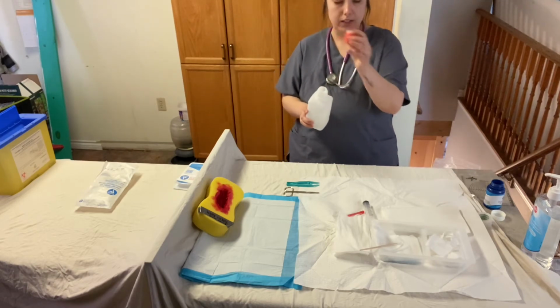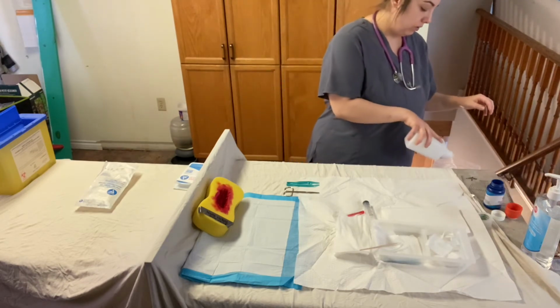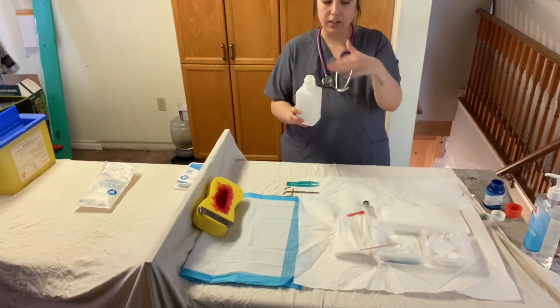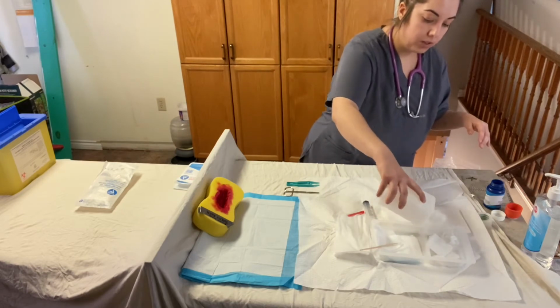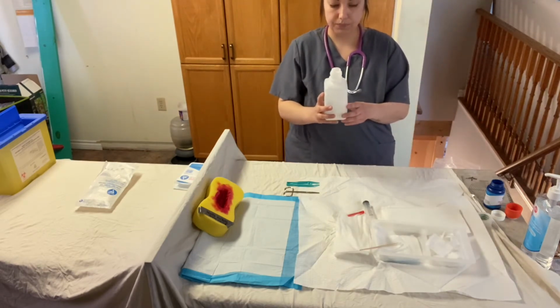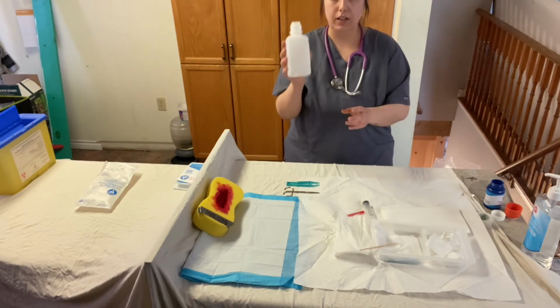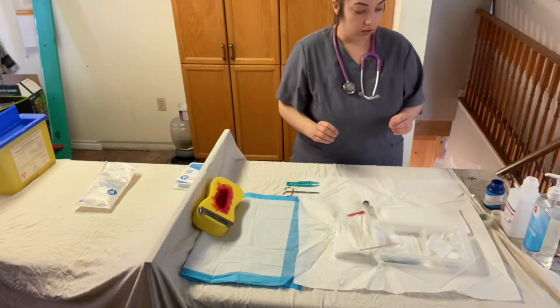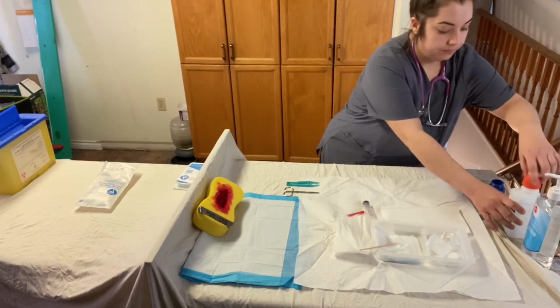I'm going to place the lid top down again for sterility. And I'm going to flip this into my garbage can. That's to ensure to clean and sanitize around the edges before placing into my sterile field. I'm going to pour some into the ribbon gauze and some in with my 2x2s. When I'm doing this, I'm always ensuring that my hand is placed on the label as I do it. Perfect. So I'm just going to cap that back up again because I'm not going to use that.